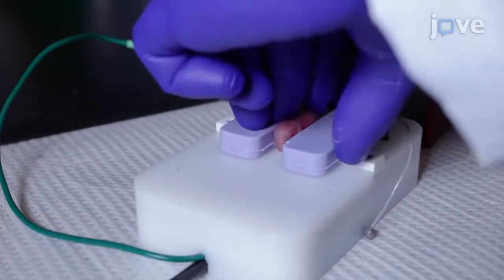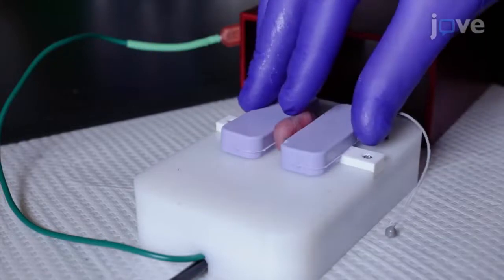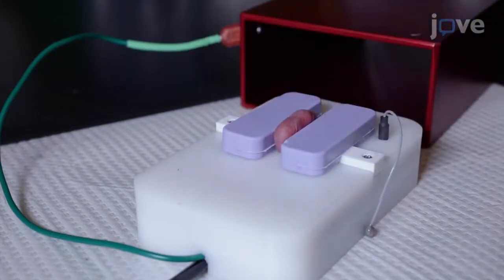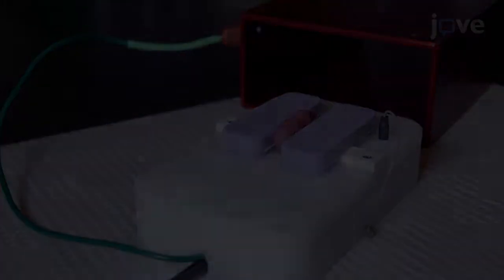Gently restrain the forearms while simultaneously applying gentle pressure to the electrodes for approximately 1 minute. When the conducting gel is set, secure the pup on the right and left side.